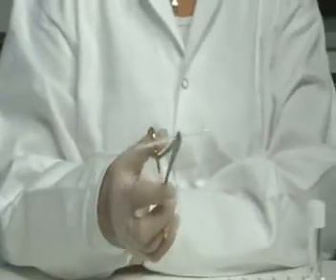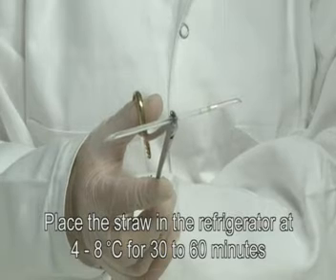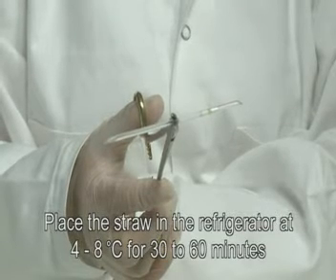Place the straw in the refrigerator at 4 to 8 degrees Celsius for 30 to 60 minutes, or into your controlled cryo chamber.